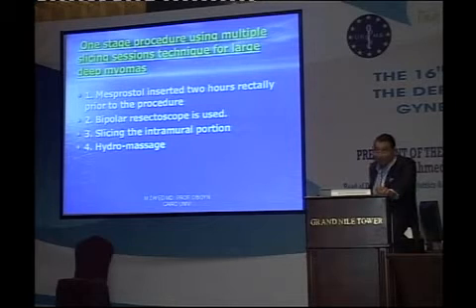We use the bipolar resectoscope. The slicing, we start by slicing the intramural portion, slicing the portion within the cavity. I'm sorry about this mistake.